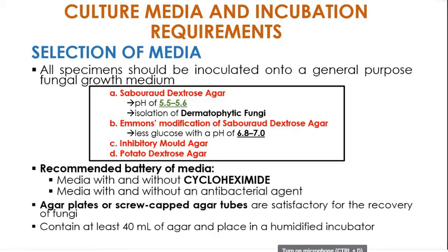So, ang recommended battery of media nyo is, as mentioned earlier din, one that should have and one without cycloheximide. And one media again with antibiotic or the antibacterial agent and another one without.